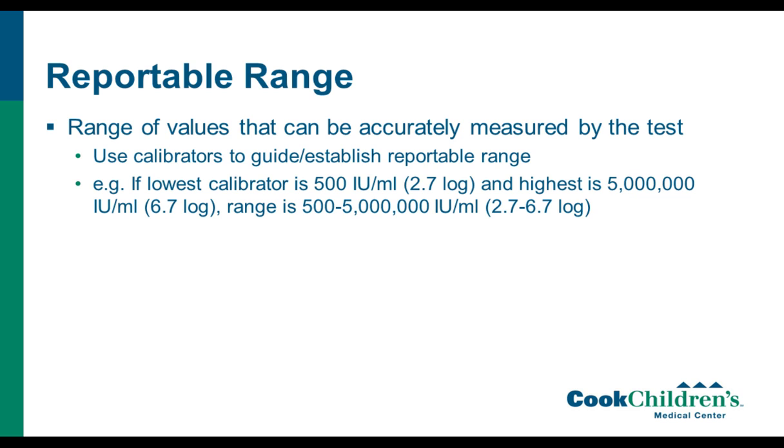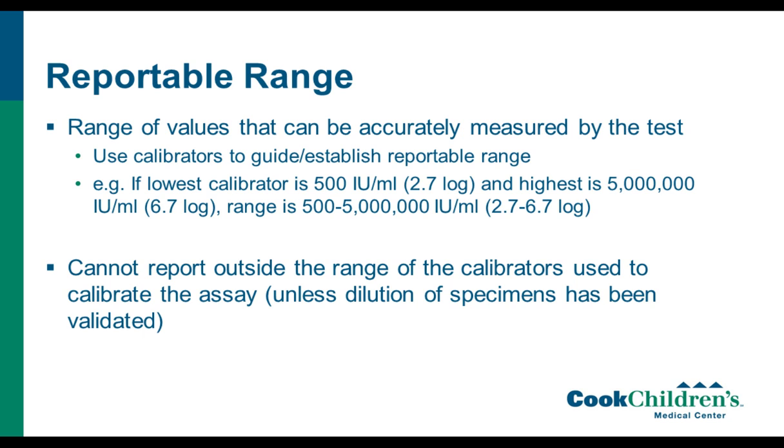And you have to have it documented somewhere, so either in your validation or verification, in your standard operating procedure, or some people also will put the range on their report that goes out into the electronic medical record. You cannot report outside the range of calibrators unless you validated that.